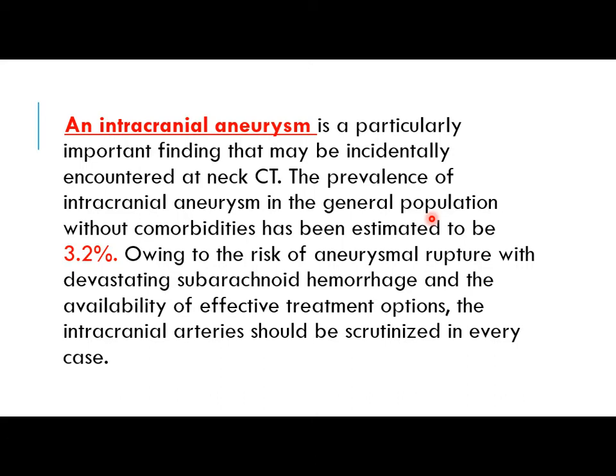Another entity which is important to look at in the case of the CT of the neck is intracranial aneurysms. As we know, a part of the circle of Willis can be assessed in our CT examinations of the neck with contrast. And it's important to identify an intracranial aneurysm because of its devastating outcome and consequences. In 3.2% of the population who don't have any symptoms, we can find an incidental intracranial aneurysm.